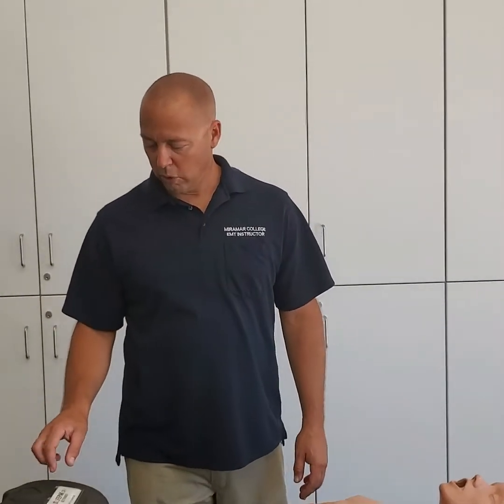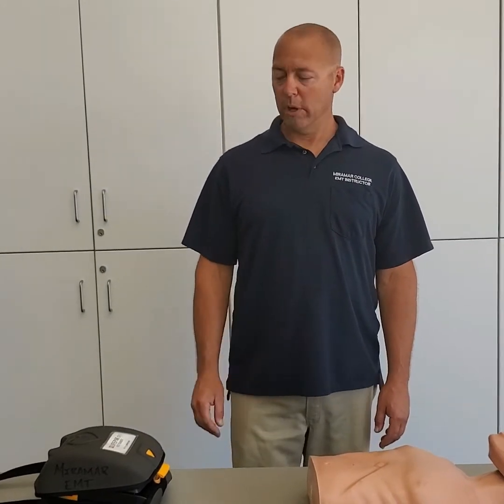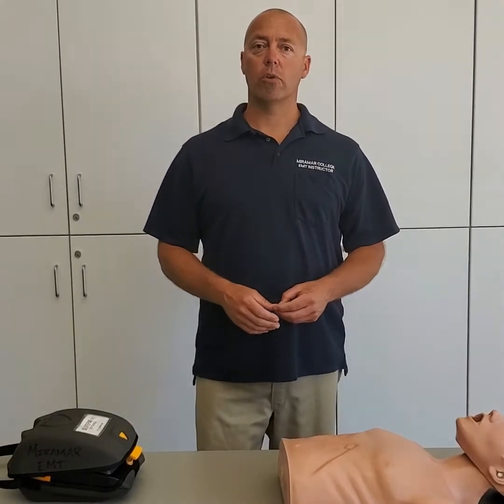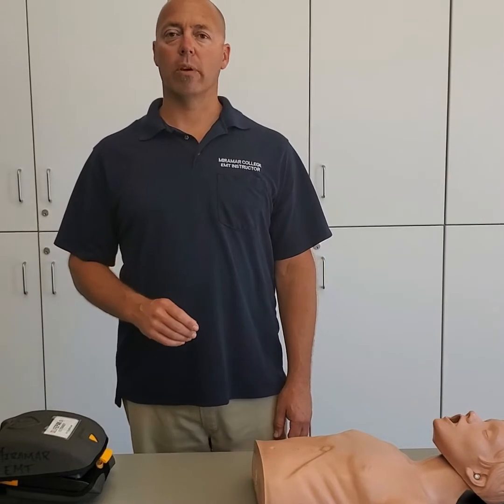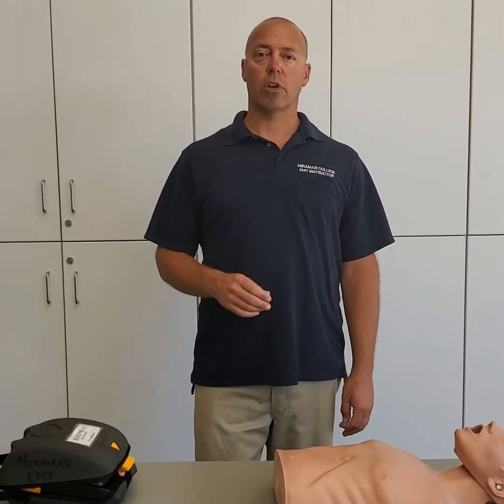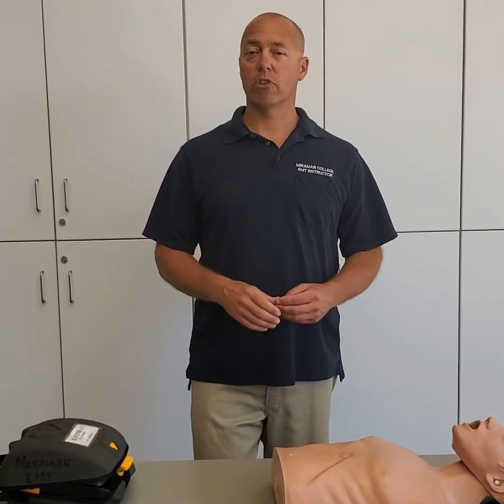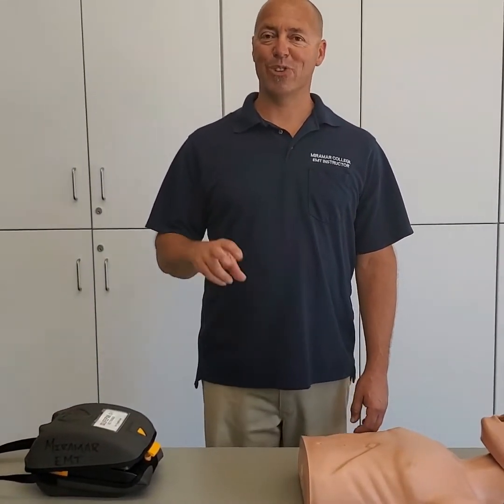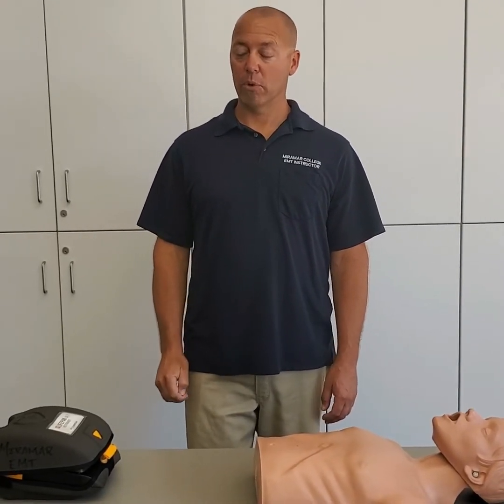All right, this is a short tutorial on how to use your AED or automated external defibrillator. Your automated external defibrillator is a machine that's going to deliver a shock to your patient, and it is designed to shock only two rhythms: ventricular tachycardia and ventricular fibrillation. Ventricular fibrillation is the most common. Again, this machine, your AED, is designed to shock either one of those.